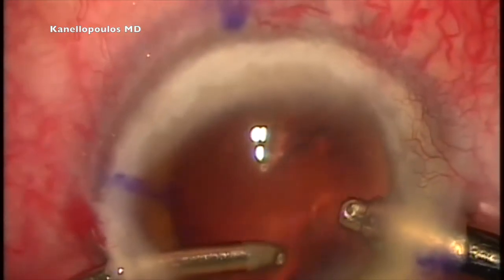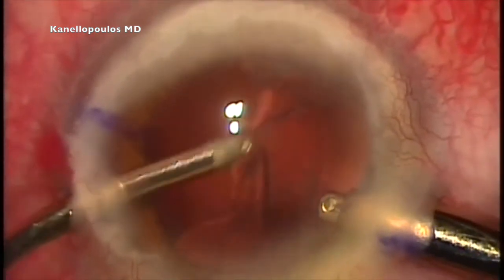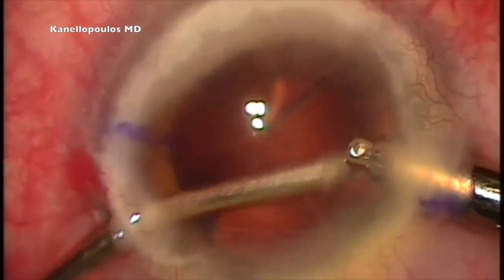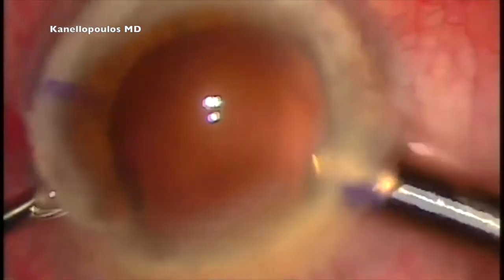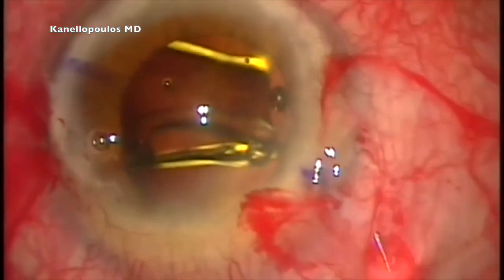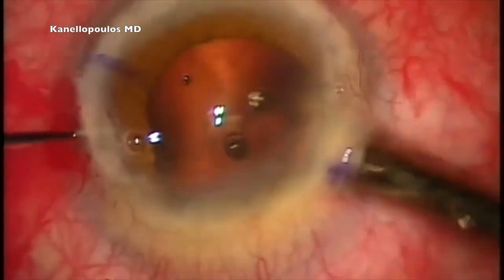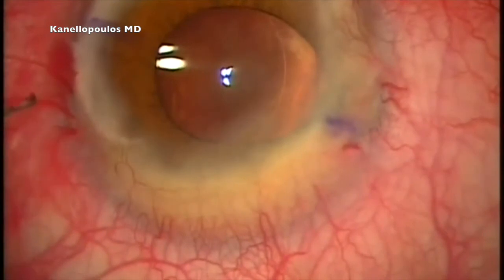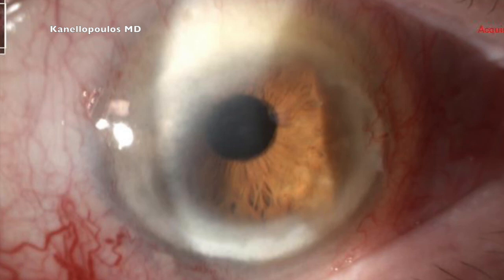And we're starting to see here what we always love in clear cornea cataract surgery: a nice red reflex, and carefully coming in to remove the residual cortical material under the capsulorhexis under direct visualization. I opt here in Greece to use peribulbar anesthesia — I only use 5cc's of lidocaine diluted with normal saline, which usually lasts for about an hour. Patients stay in our ambulatory surgery unit for a half hour after the procedure and their eyes attain full mobility and no double vision. The toric IOL is implanted and I'm making sure the lens is right at par with my marks at 150 degrees. The patient a month later is enjoying 20/25 uncorrected visual acuity.